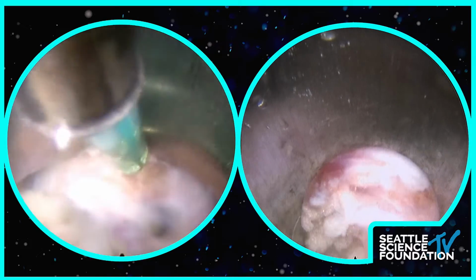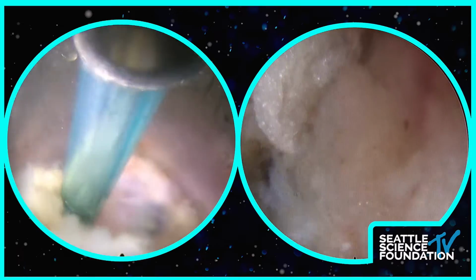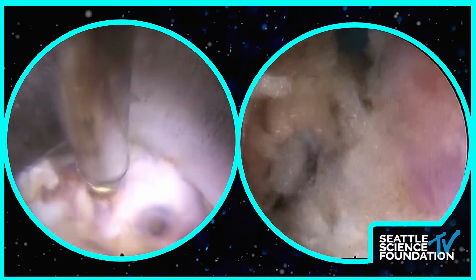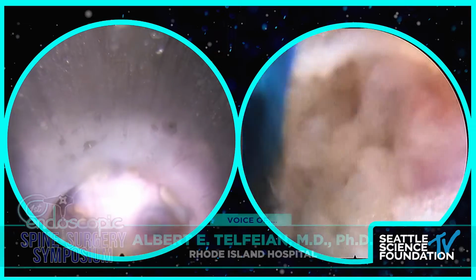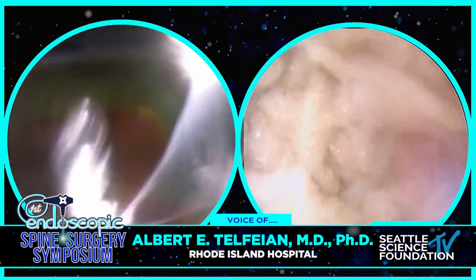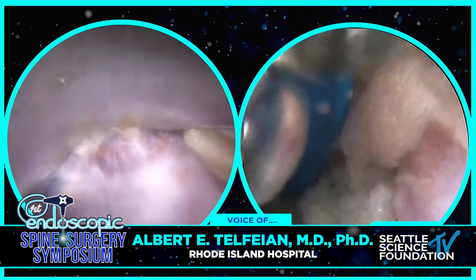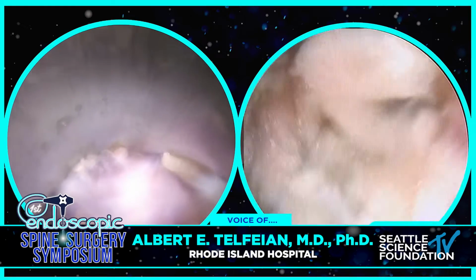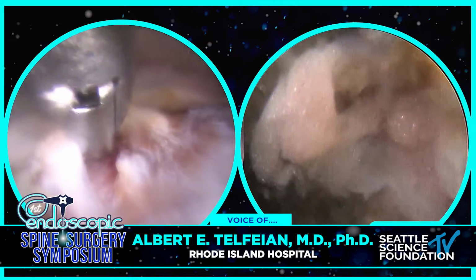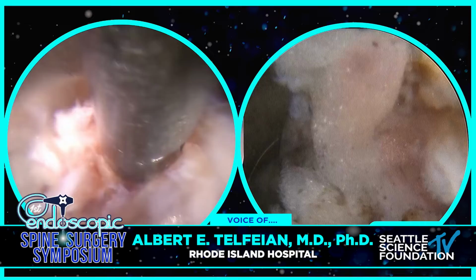Albert does something very similar with this transforaminal technique. Albert, do you want to talk a little bit about how you take the cannula and do the same thing transforaminally? Yeah, so what Sakib is talking about is, when we're doing transforaminal, the beveled cannula, when you go in facing down and have that sliding underneath the traversing nerve root, it's really acting as a retractor. So you can really advance it to the midline and address a disc herniation, and then turn it up and see the traversing nerve root. That's a good point, Sakib.